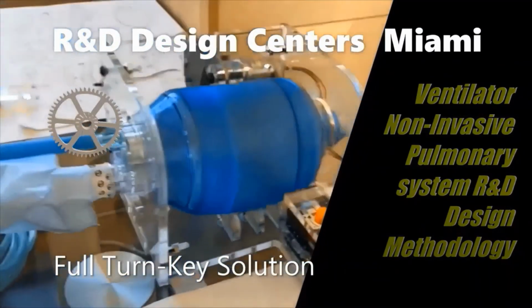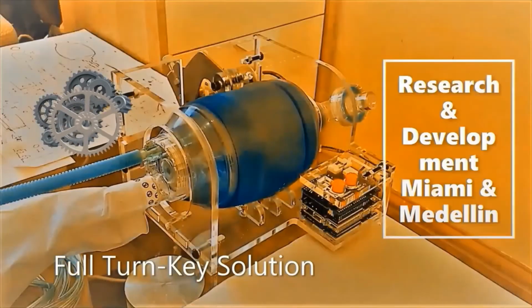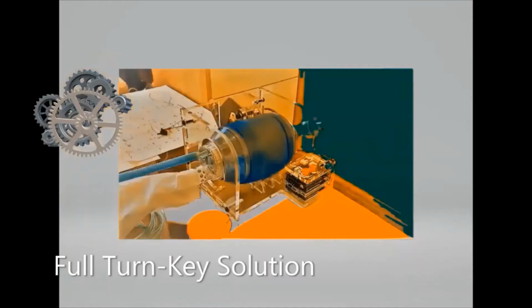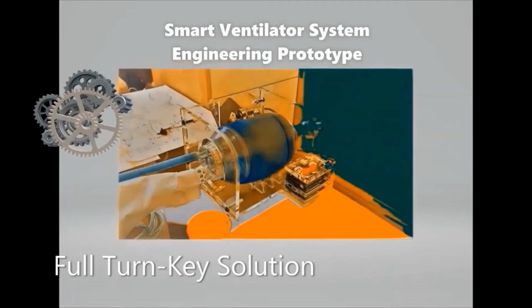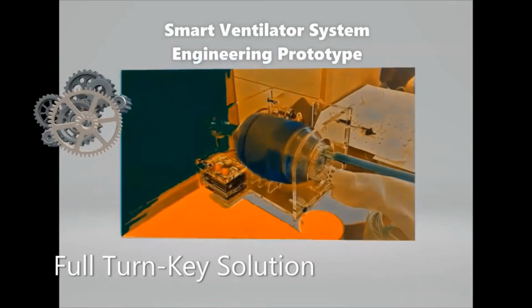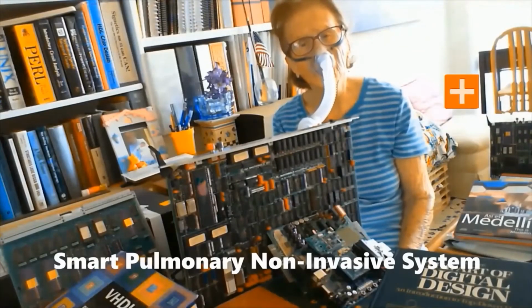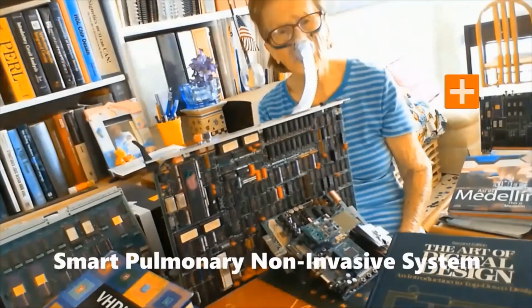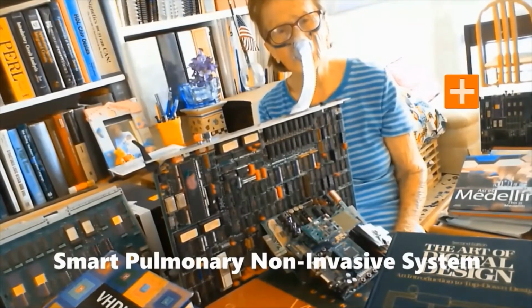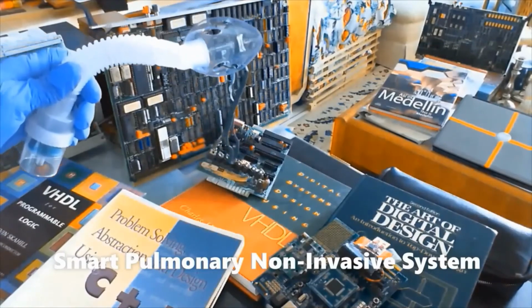microprocessor pressure ventilator consists of a compressible air reservoir, air and oxygen supplies, a set of valves and tubes, and a disposable patient circuit. The air reservoir is pneumatically compressed several times a minute to deliver room air and air-oxygen mixture to the patient.